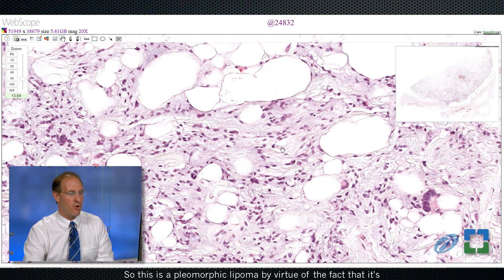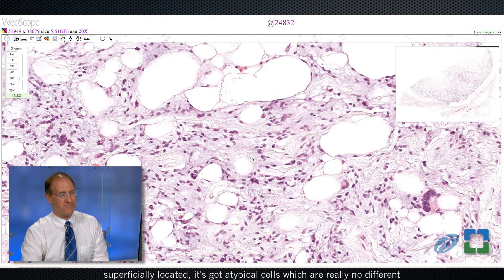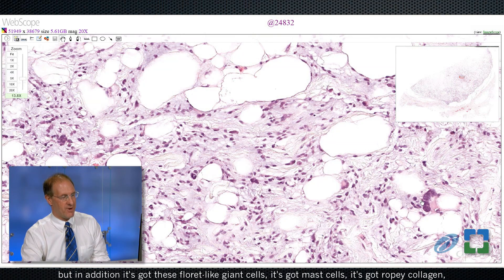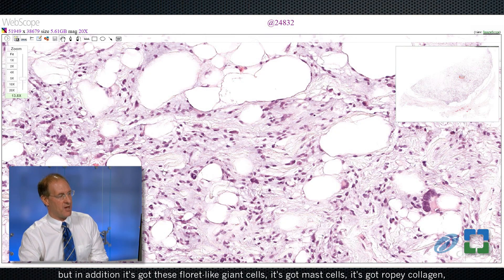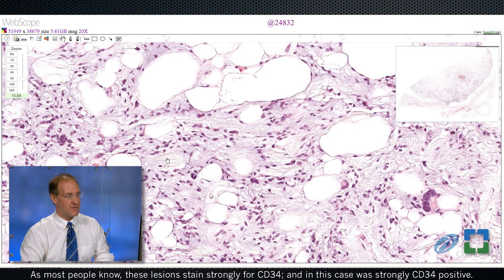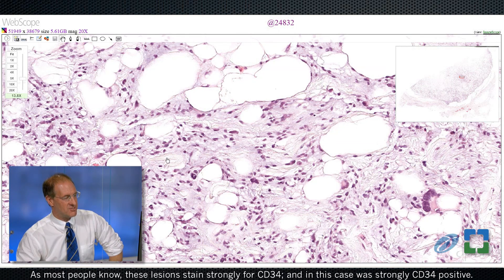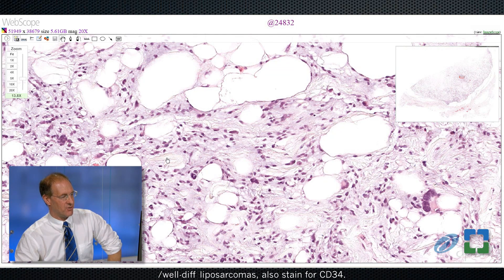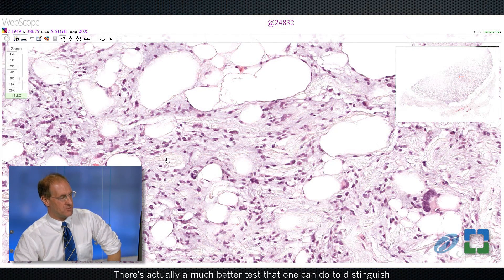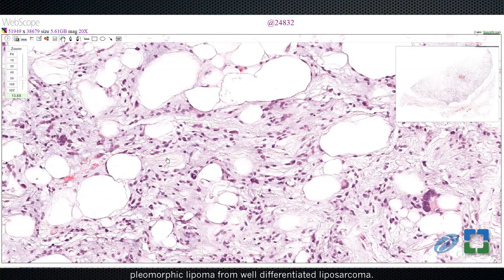This is a pleomorphic lipoma by virtue of the fact that it's superficially located. It's got atypical cells, which are really no different than the atypical cells seen in a well-differentiated liposarcoma. But in addition, it's got floret-like giant cells, mast cells, and ropey collagen, and the clinicopathologic setting is entirely consistent with a pleomorphic lipoma. These lesions stain strongly for CD34, and this case was strongly CD34 positive — though I don't find that particularly helpful since atypical lipomatous tumor/well-differentiated liposarcoma also stains for CD34. There's actually a much better test to distinguish the two.